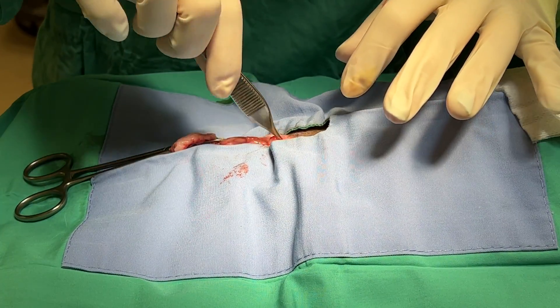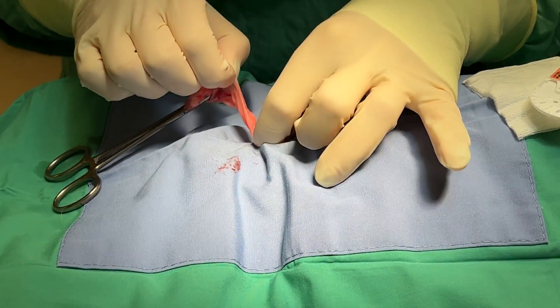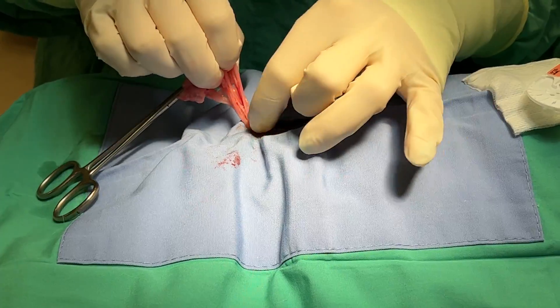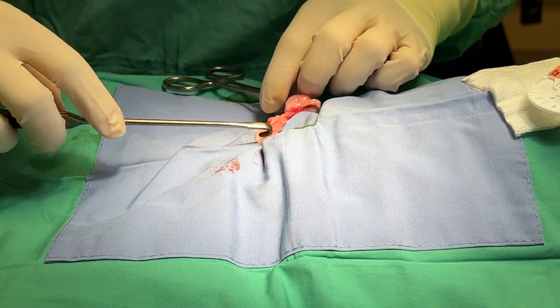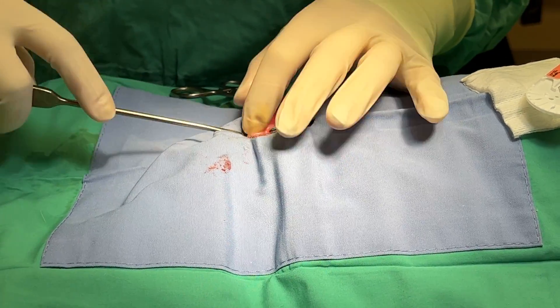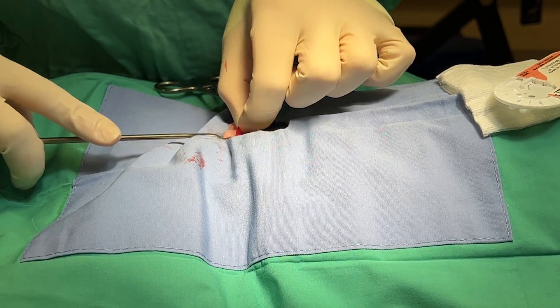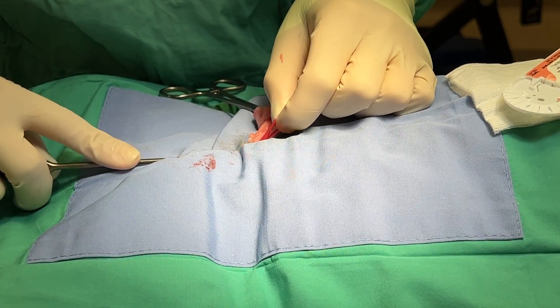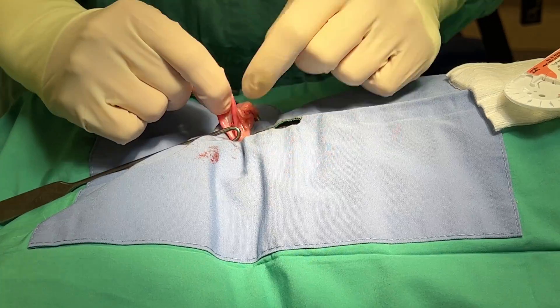This omentum we can put back inside, and we can follow this to the other side. The bifurcation is right here. If you have difficulty finding that bifurcation, take your spay hook and grab the body wall — just the body wall — pull caudally, and then with your uterine body, grab it proximally, pull cranial, then reflect it caudal, and drop your spay hook.